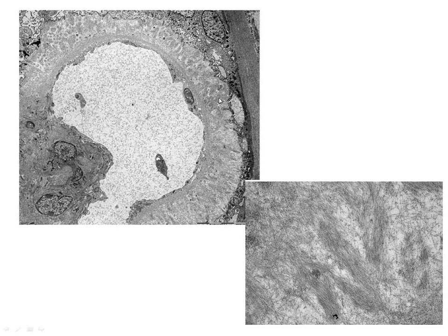I think this is the actual case that we were talking about with the WSAVA. Because humans have this appearance often, they actually call it Roman helmets or coxcombs, like rooster combs. That's their little terminology for it. And so we thought, well, if humans have this appearance and they also often have light chain, could this be light chain amyloid?